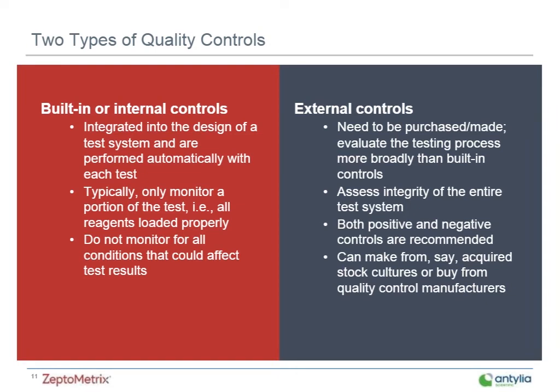Really, the purpose of a quality control, an external quality control specifically, is to validate the reliability of your test system and also to evaluate your operator's performance and the other environmental conditions that could impact your test results.